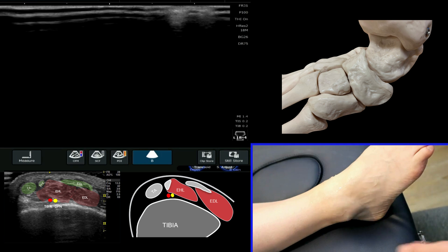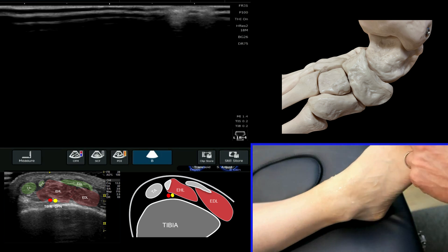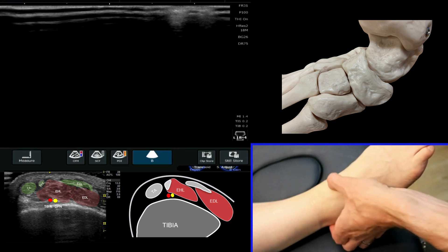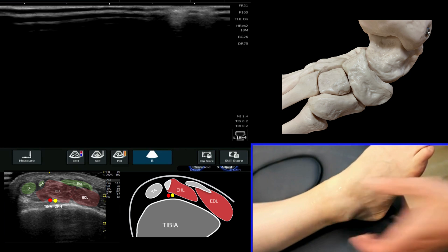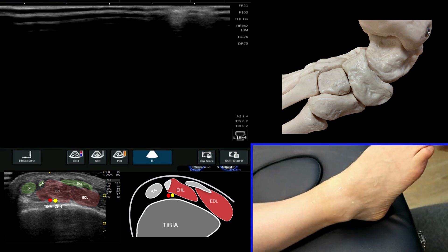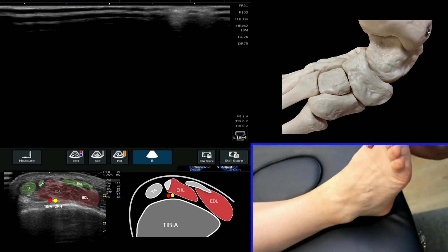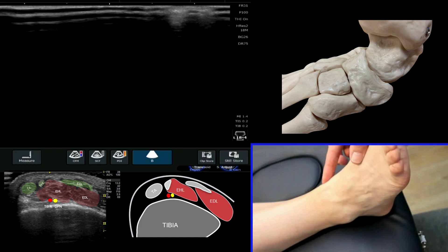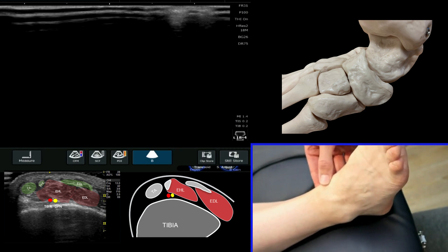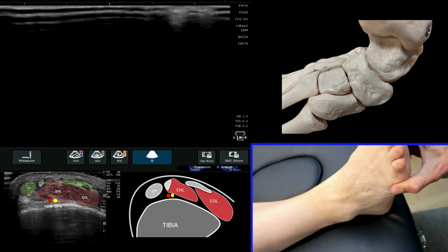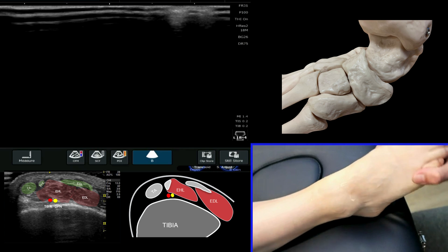Thinking about anatomical soft tissue landmarks, anteromedially we have a large tendon in this area which is your tibialis anterior. If I ask the patient to push up against me into dorsiflexion and hold there, you can see this prominent ridge — this is your tibialis anterior tendon — that then runs down medially to attach onto the medial aspect of the midfoot.